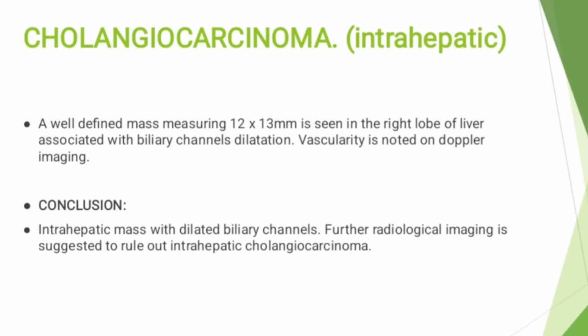Intrahepatic cholangiocarcinoma, as I mentioned, cholangiocarcinoma is of three types: intrahepatic, intraductal, or hilar region. And the differentiation between the hepatocellular carcinoma and the cholangiocarcinoma is that in cholangiocarcinoma there will be intrahepatic biliary channel dilatations, while in hepatoma there will be no intrahepatic biliary channel dilatations.